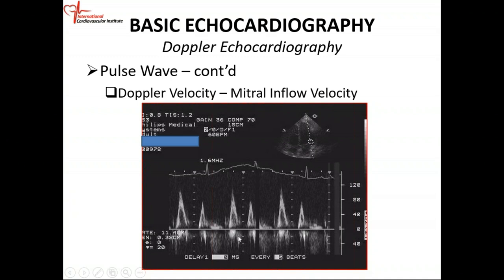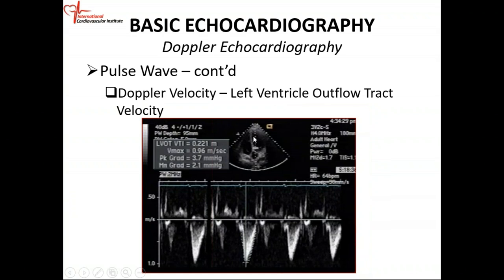Your ECG is on top. Diastole is from the end of the T wave to the beginning of the QRS. This is your E-velocity and your A-velocity.